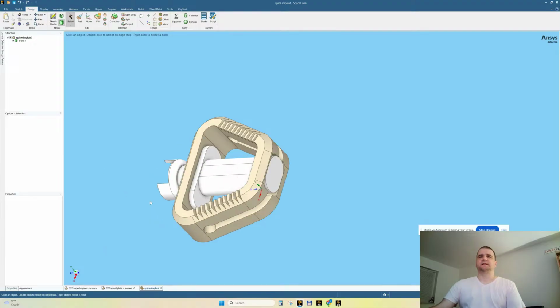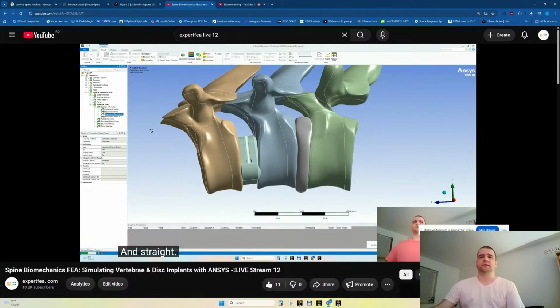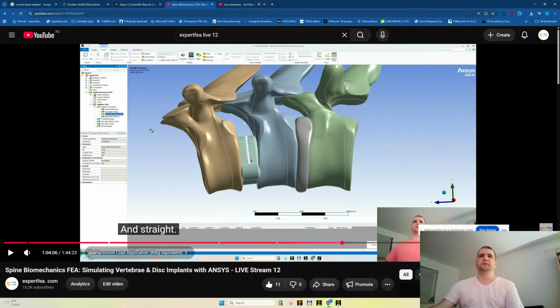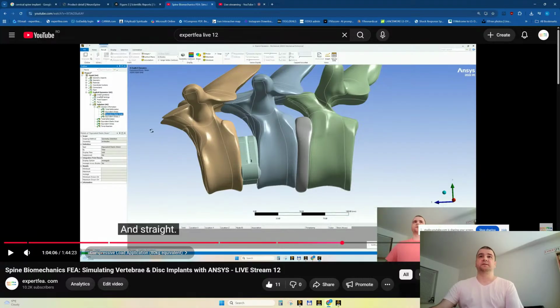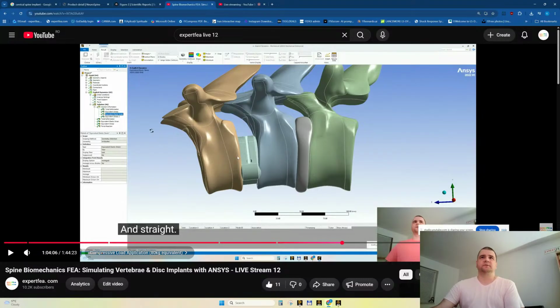All right. So also, as a short reminder, please take a look also at my live stream 12, because I have done something similar. Now I will move to the next stage. I'll complicate it, let's say, yes? We have fewer vertebrae here, only 3, and yes, this is a simpler case, made in explicit dynamics. My intention now is to start with static structural. Why? Because I would like to see the contact details. I'm talking about contact pressure, which cannot be found out in explicit dynamics, only in static and transient structural. So this is my intention, to work with static structural.